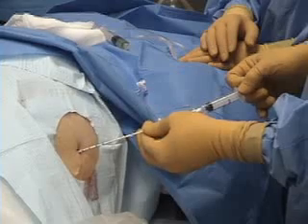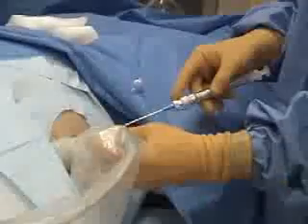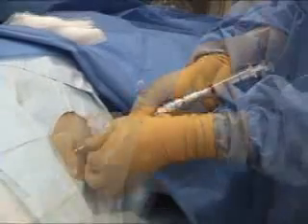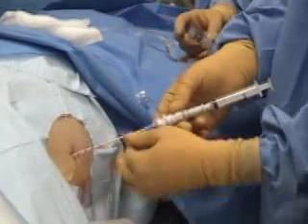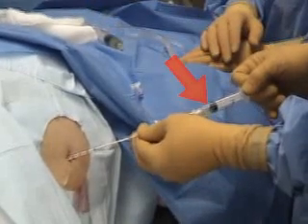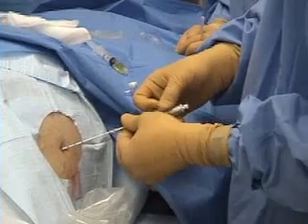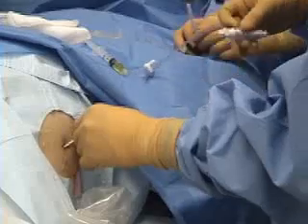Intermittently pull back on the plunger as you continue to advance the needle through the subcutaneous tissue. Bedside ultrasound may be used to confirm proper placement. You may feel a sudden loss of resistance when the needle pierces the peritoneum. Immediately stop advancement once the ascitic fluid begins to fill the syringe. Next, guide the plastic catheter over the needle and into the peritoneal cavity, and then remove the needle.